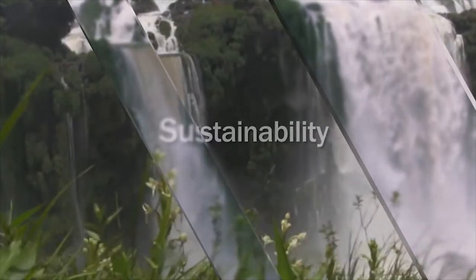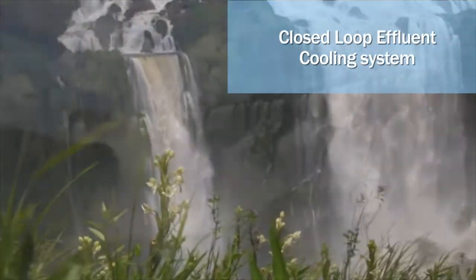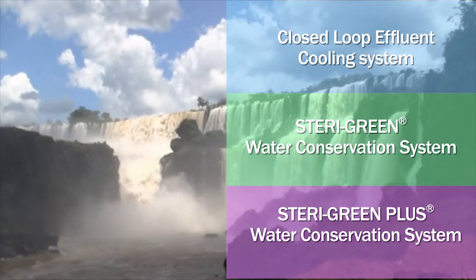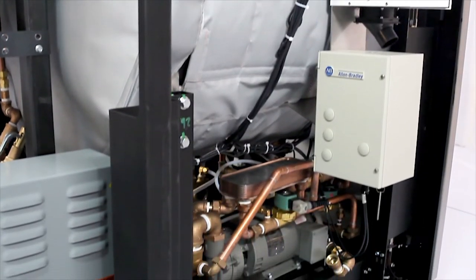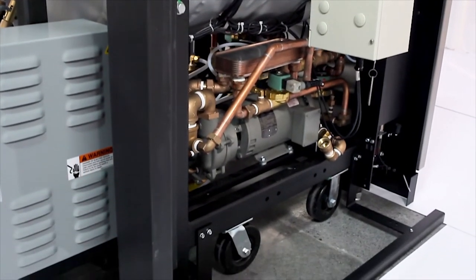Knowing the importance of sustainability, the AMSCO Medium LS series comes standard with several energy-saving systems and can be configured with one of three optional water conservation systems. The closed-loop effluent cooling system is a simple alternative to save water used to cool steam effluent generated by gravity and liquid cycles.